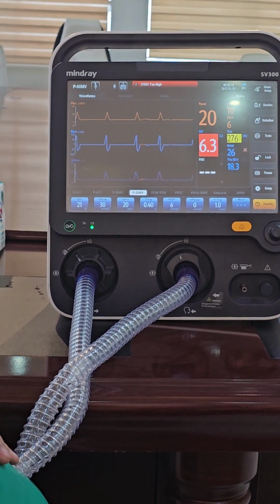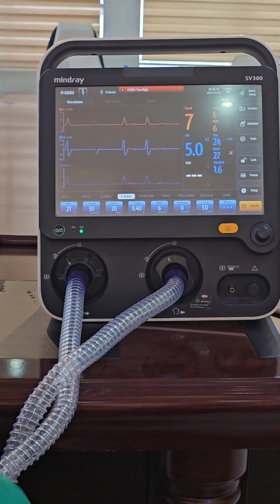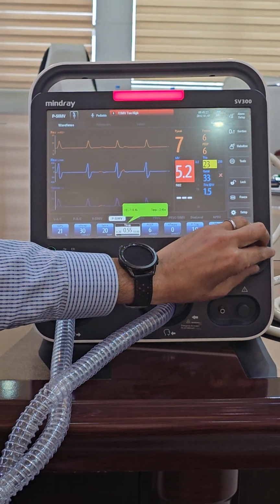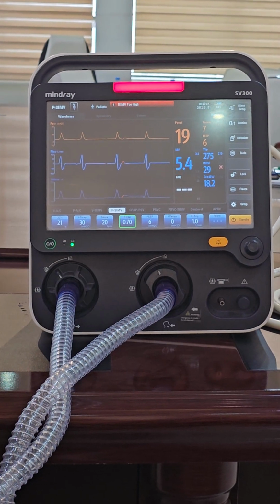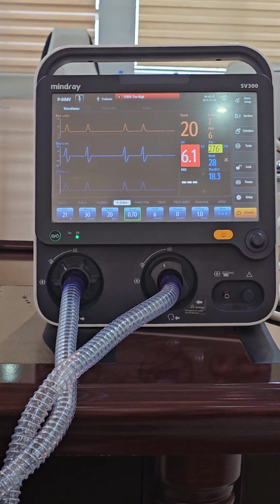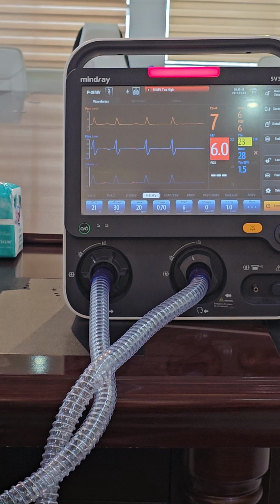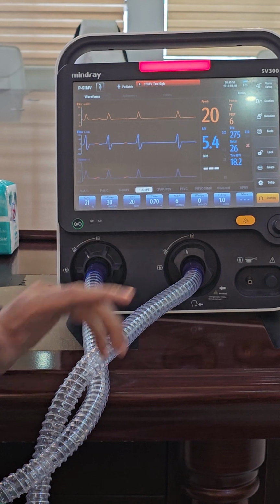However, we cannot leave it open, otherwise the patient will stop breathing. We have to put a backup rate. And to give time for the patient to build the flow, we make the backup rate very long. So if we go PSV, we have to go to this and make it very prolonged. But that does not mean the patient will make 0.7. You understand? But if he couldn't do it by flow within 0.7, the machine will help. Yes. So that's why in PSV, we give it only for strong patients. We don't give it for a long time. We don't give it for sedated or comatose patients, and the inspiratory time should be prolonged.